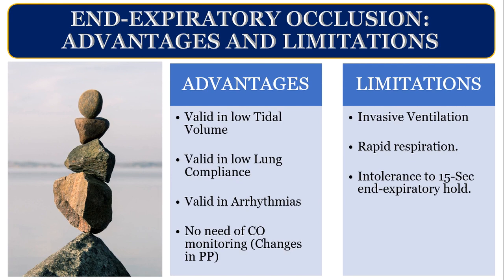Advantages: it is valid in low tidal volume ventilation, valid in low lung compliance. You can use pulse pressure. It is valid in arrhythmias. But disadvantages: you can't do it in a patient who is not ventilated. Can you do it? पहले हम इंटूबेट करेंगे, एंड एक्सपिरेटरी ऑक्लूजन करेंगे, फिर एक्सटूबेट कर देंगे. नहीं, ऐसा नहीं हो सकता है. Also, a patient who is breathing very rapidly will probably not be able to tolerate it. So it's a limitation.